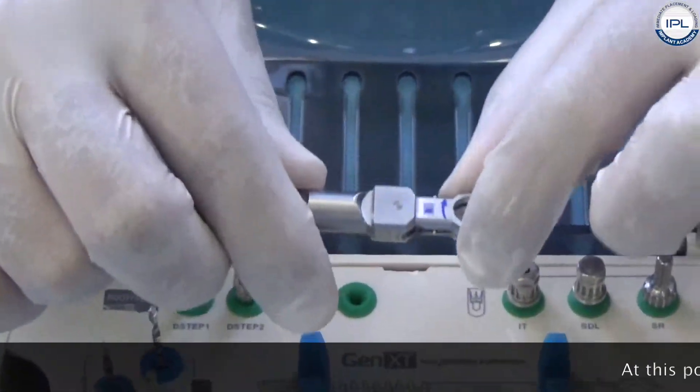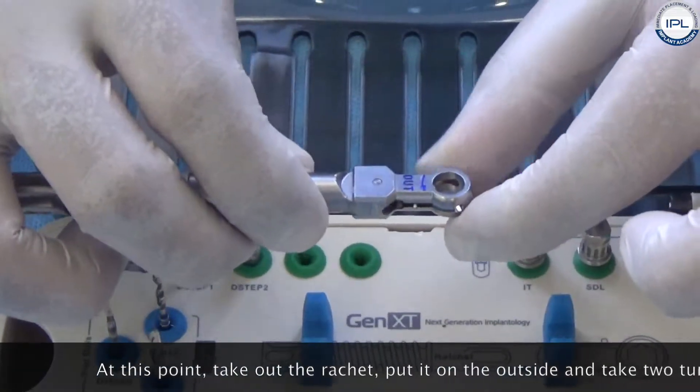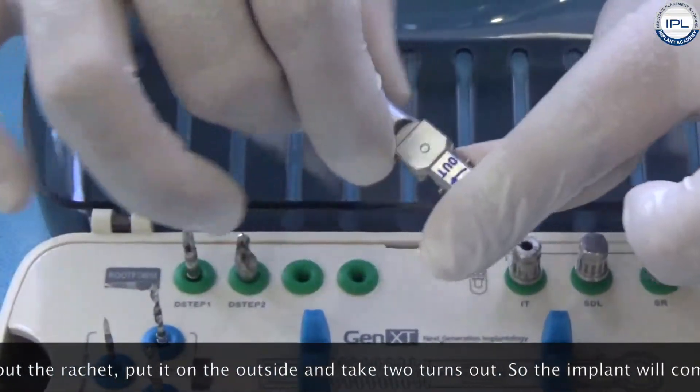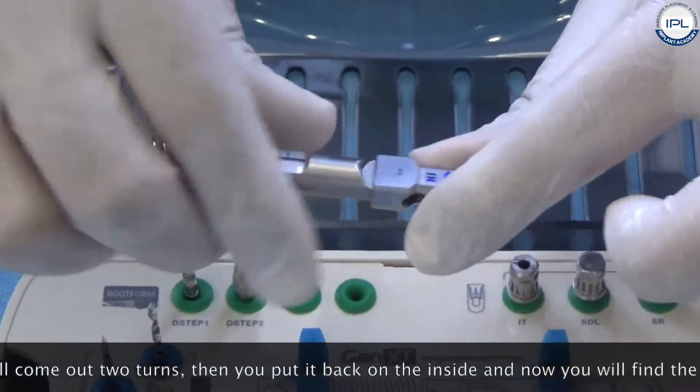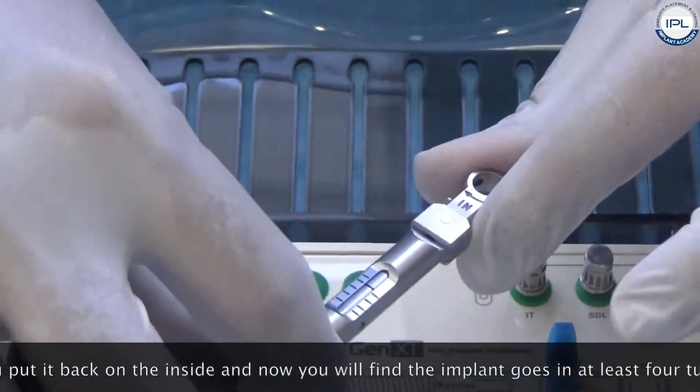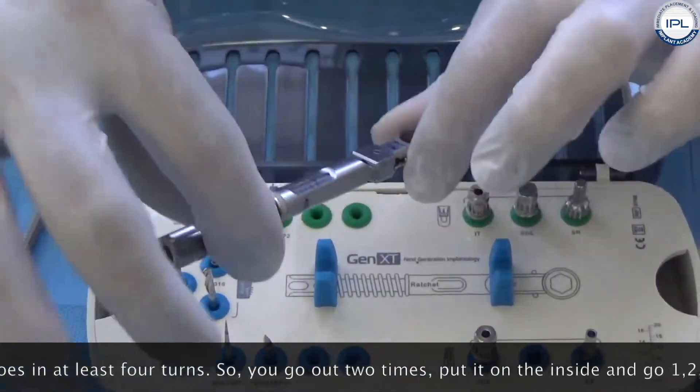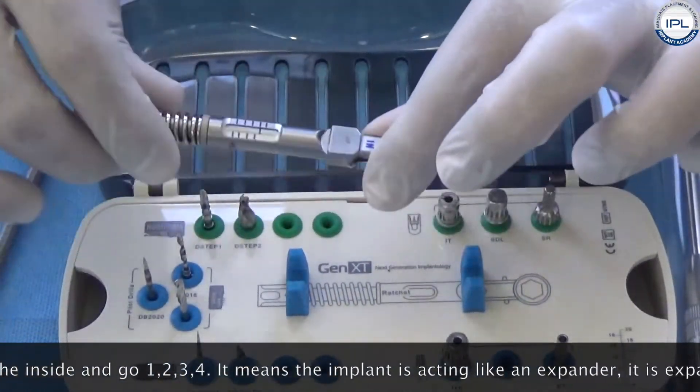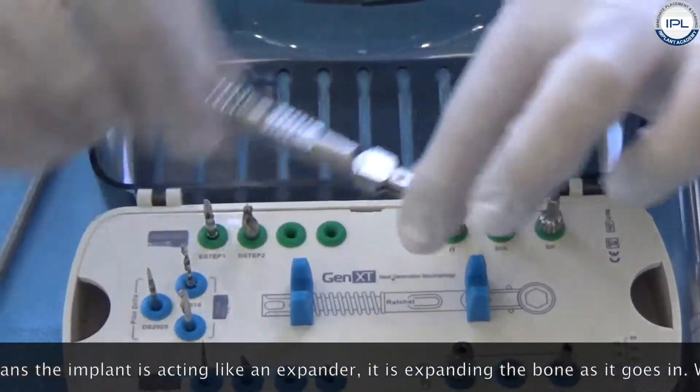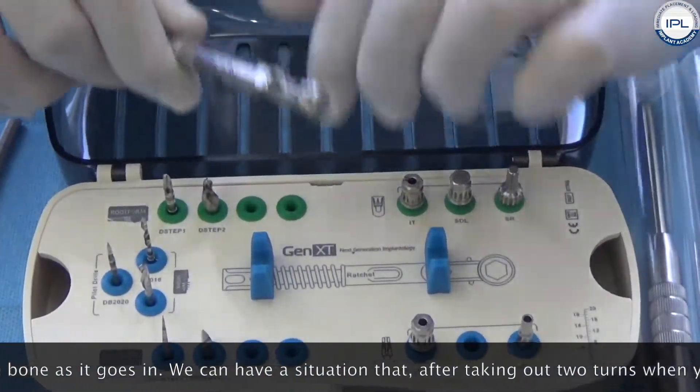I recommend at this point that you take out the ratchet, put it on the outside and take two turns out. So the implant will come out two turns, then you put it back on the inside and now you will find that the implant will go in at least four turns. So you go out two times, then you put it on the inside and go one, two, three, four. That means this implant is now acting like an expander. It is expanding the bone as it goes in.